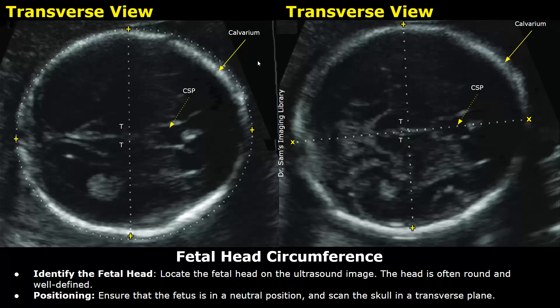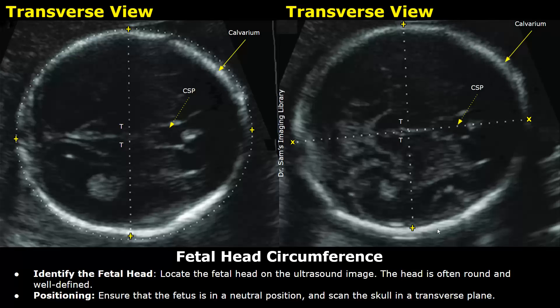To measure the fetal head circumference, first you have to identify the fetal head. Ensure that the fetus is in a neutral position, which means the neck is not flexed or extended. Scan the fetal head in a transverse plane. This bright hyperechoic structure is the skull bone or the calvarium.